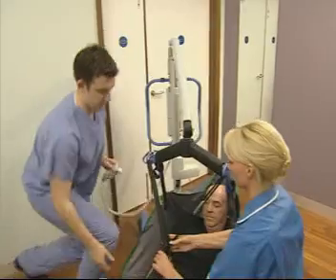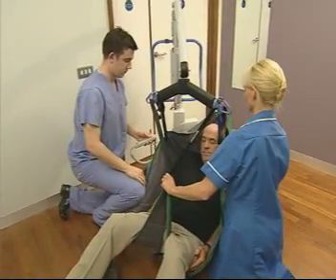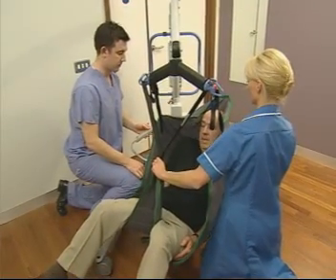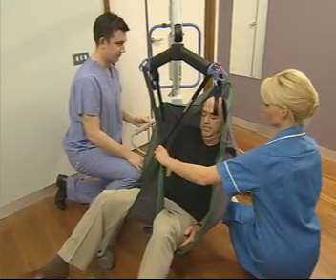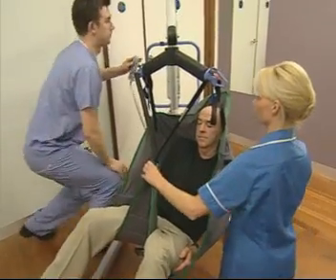Reassure the patient while beginning the lift and control any movement as you gently lift them from the floor. The second carer may need to pull the neckpiece around the back of the head to support it. As you raise the patient, the sling may move slightly as the patient slides into a sitting position.